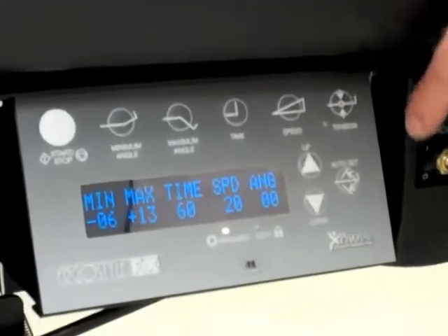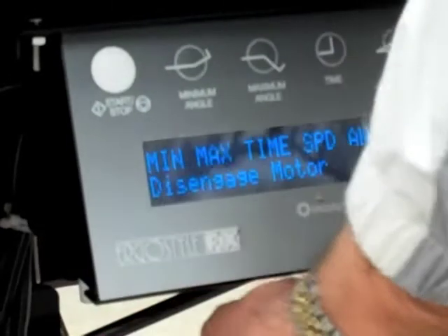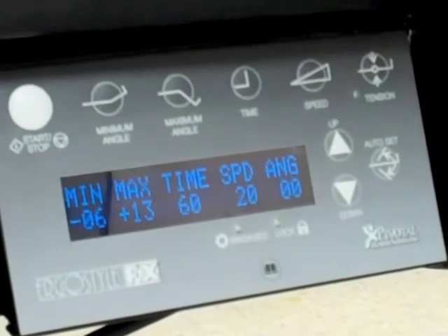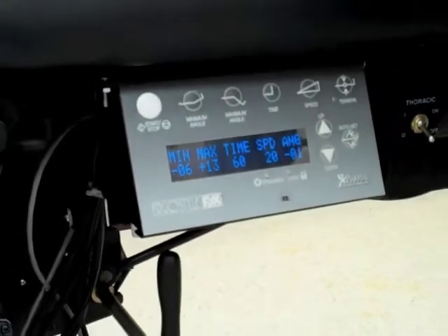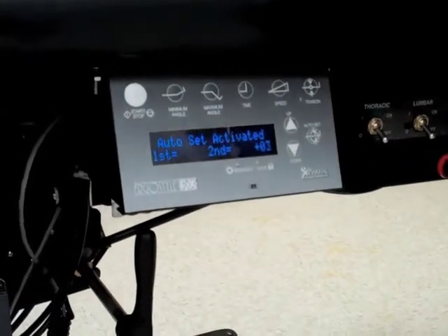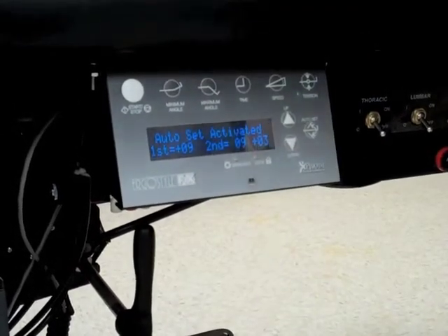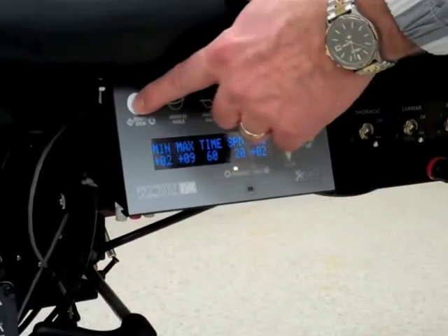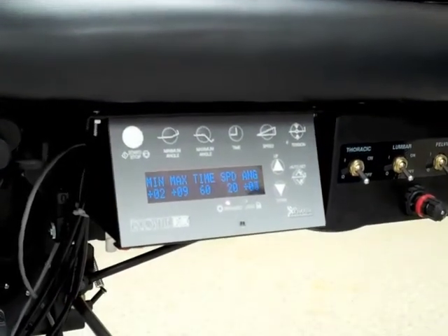We also have a feature called auto set. The auto set will have the table locked in position. If I want to set the stroke manually for auto flexion, I'm going to engage into manual flexion, push the auto set button, take the table manually down and lock it, bring it up and lock it. Then I'll engage auto flexion and start the table — I have now just set the stroke manually for my patient.